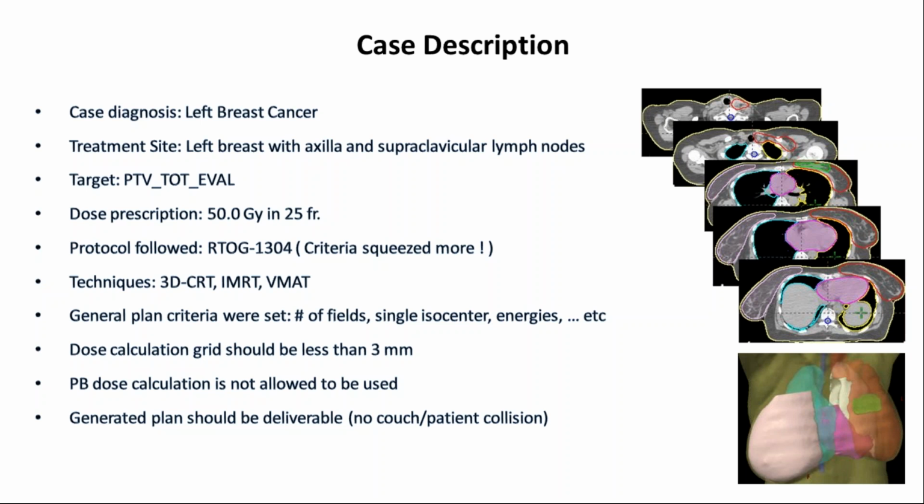Our next competition will focus on IMRT and VMAT, and we will try to select different cases for 3D CRT, because for breast cases, nowadays most people are using 3D CRT. This is why I allowed the 3D CRT technique to participate, and we have really great results from the 3D CRT that even some IMRT planners could not achieve.